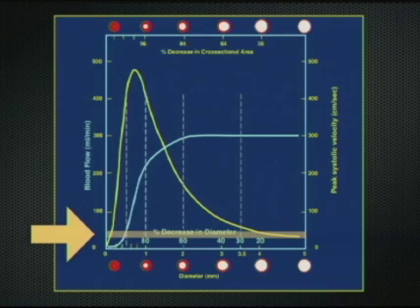As we recall from this diagram, as the vessel narrows, velocity increases, but as we approach complete occlusion, the velocity decreases again, finally coming to zero at the time of complete occlusion. So as you can see, there's a point as the vessel approaches complete occlusion in which the peak systolic velocity may be very close to that which is seen in a normal vessel. What is helpful in differentiating the normal peak systolic velocity from the waveform approaching complete stenosis is the presence of turbulence, which is reflected by extreme spectral broadening.